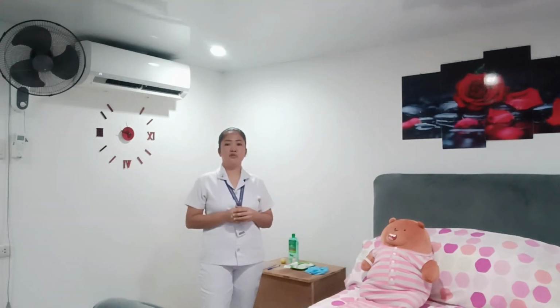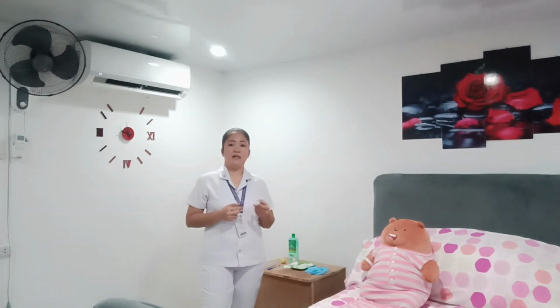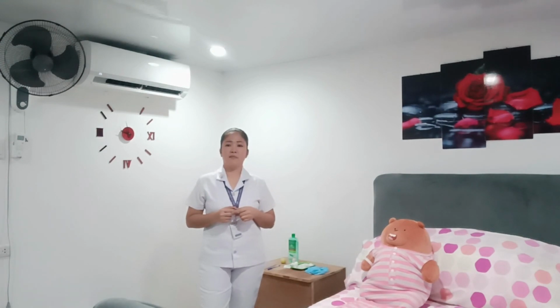We also have to do the 3 steps of checking. First one is to read the label of the medication when it is taken, and also before and after withdrawing the medication.